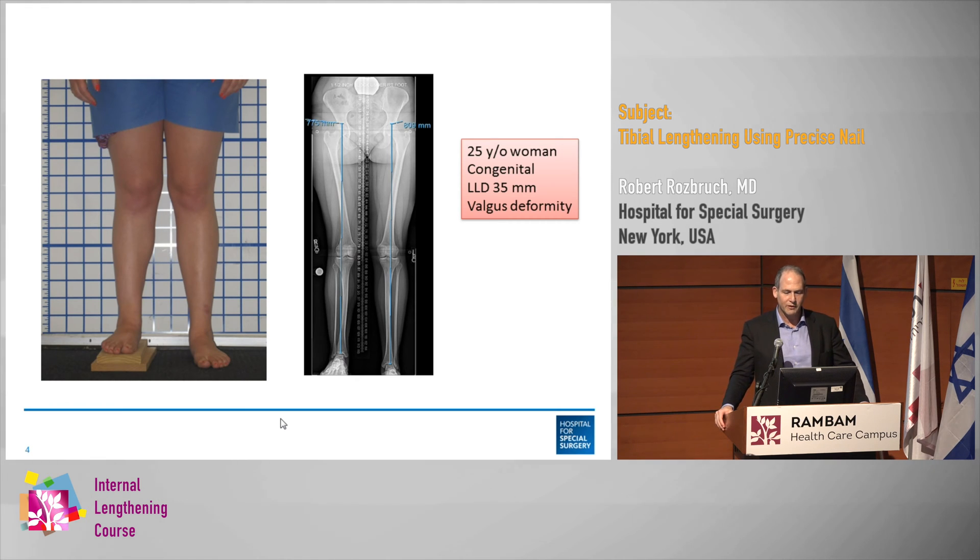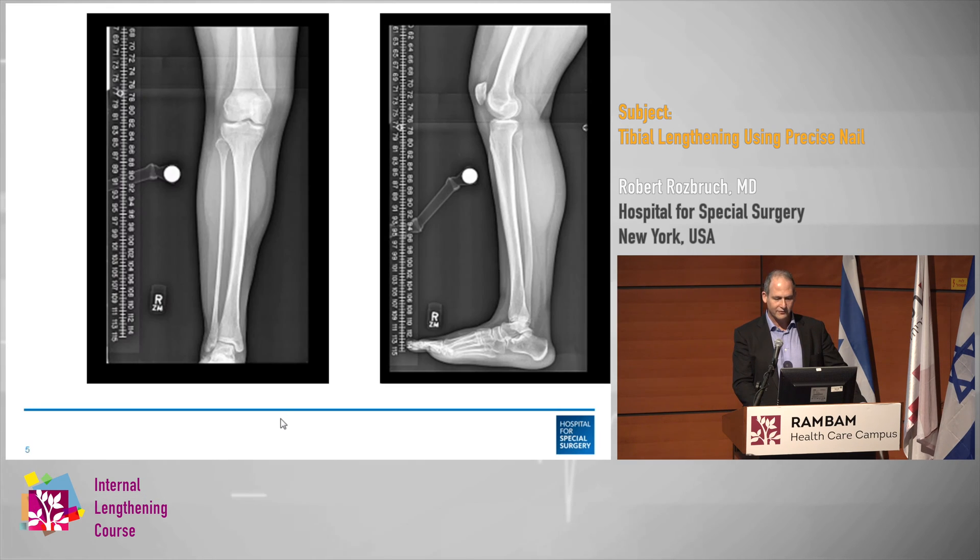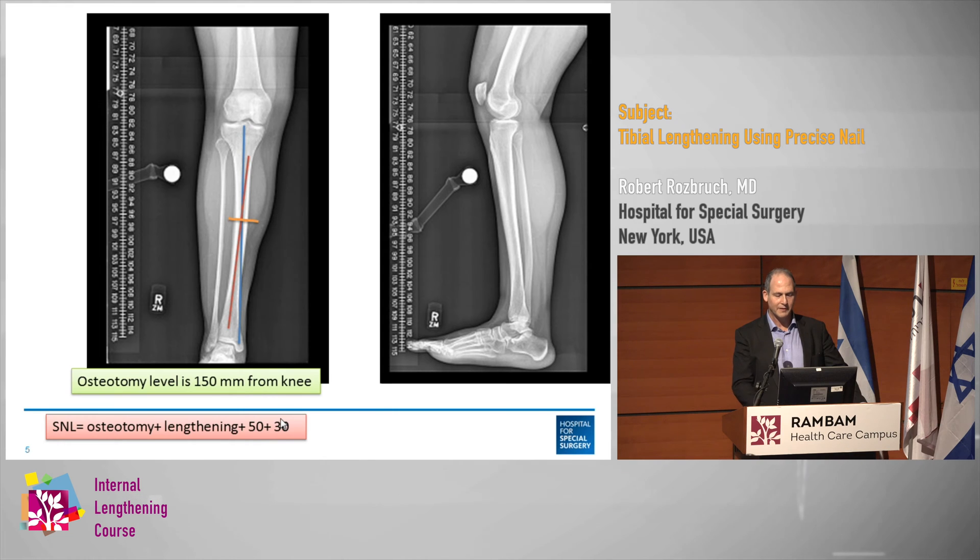Here's a woman with a 25-year-old congenital LLD, 35 millimeters of discrepancy, and a valgus deformity. These are her preoperative x-rays. You can see there's an apex of deformity, so we're going to cut the bone at that apex. I plan my nail length based on the osteotomy level plus the lengthening, plus 50, plus 30.